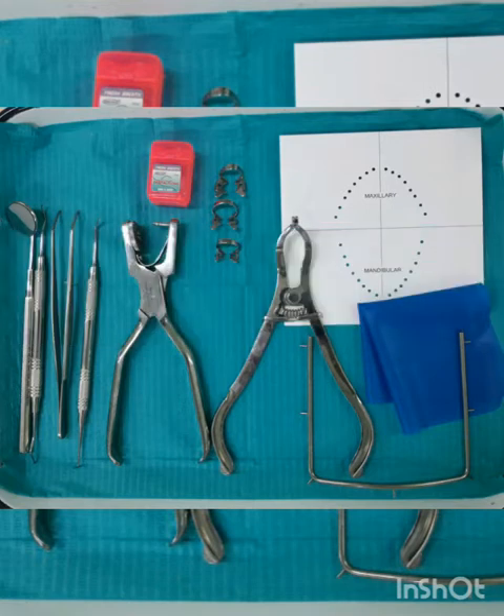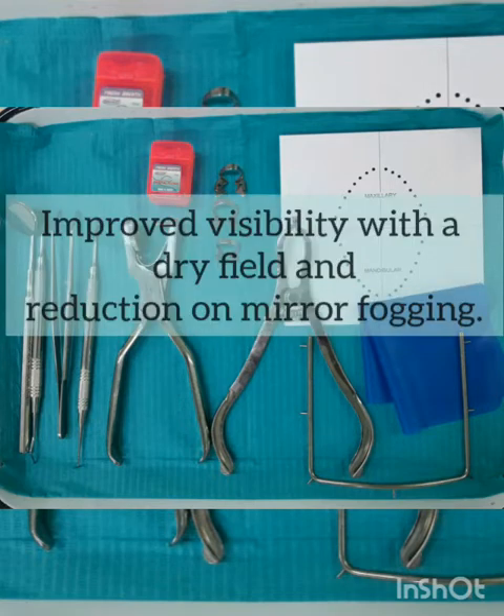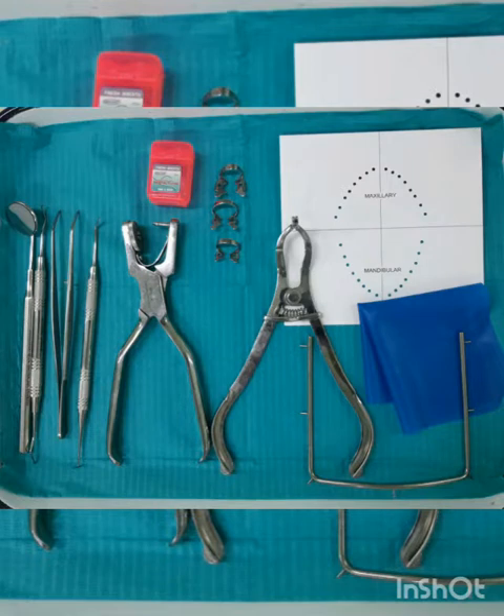We also want to retract and protect our soft tissue. With the rubber dam, visibility is improved. The rubber dam provides a dry field and reduces mirror fogging. Lastly, efficiency is increased because the rubber dam minimizes patient conversation during treatment and the need for frequent rinsing. Those are the advantages why we use rubber dam in endodontics.